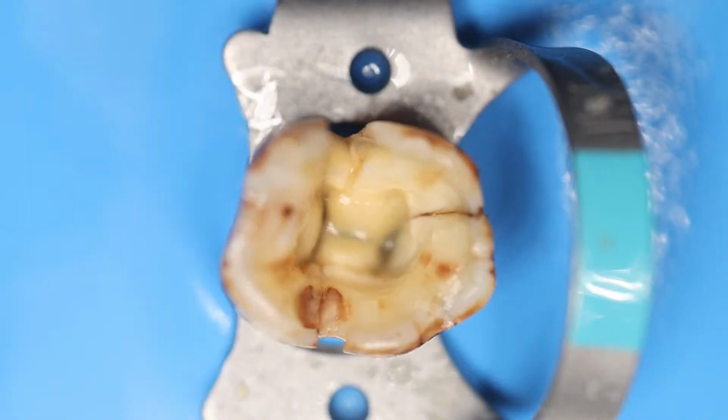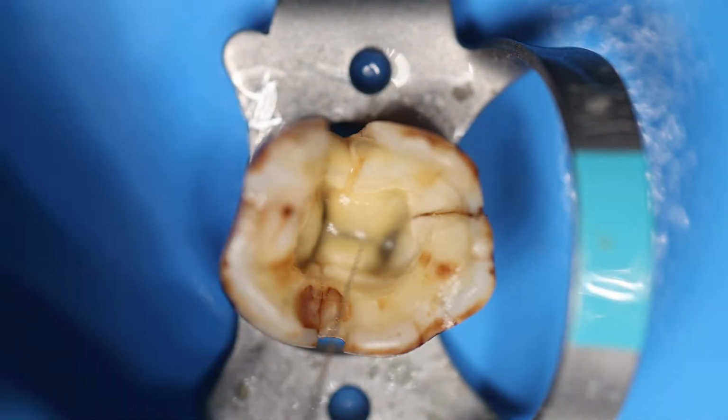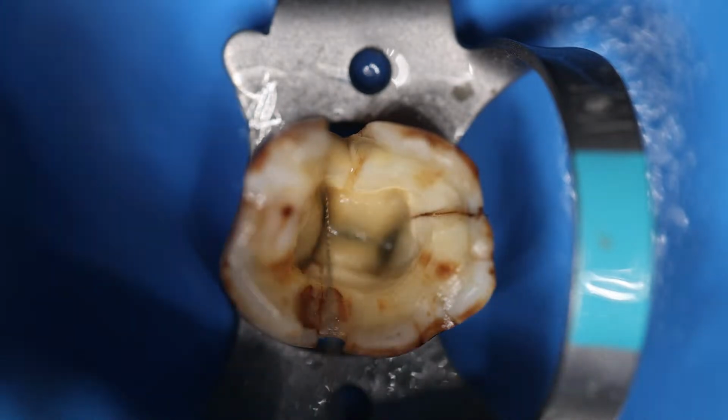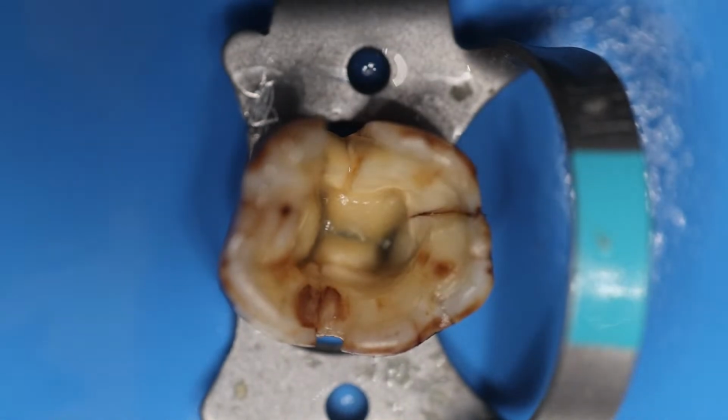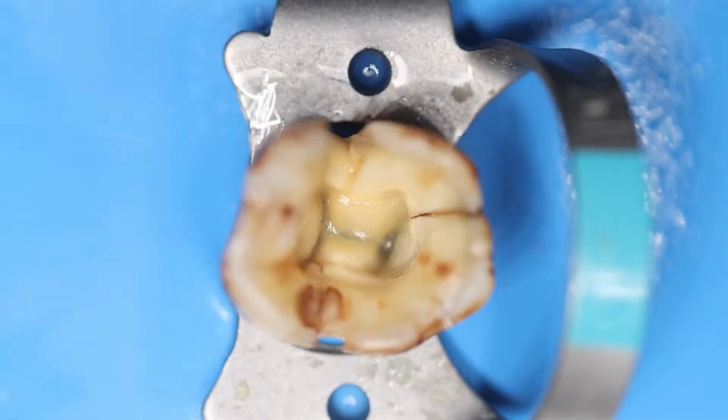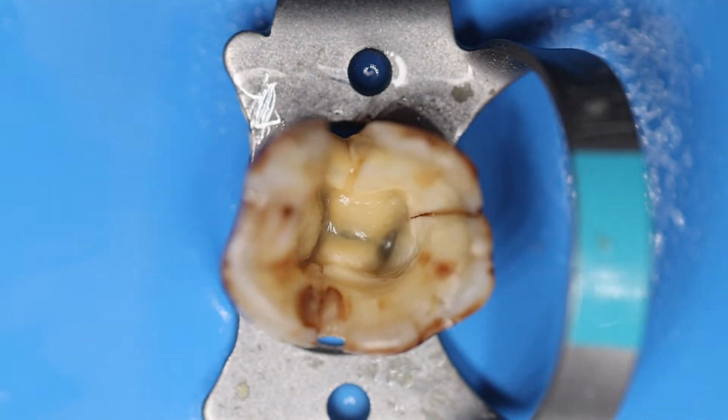And now you clear the file again. We have not taken the working length, we are just going for the initial negotiation. Okay, see, we are in the mesiolingual canal, just going freely, as freely as we can go, and we are assured that there is a resistance. And now you can visualize that these are the canals.